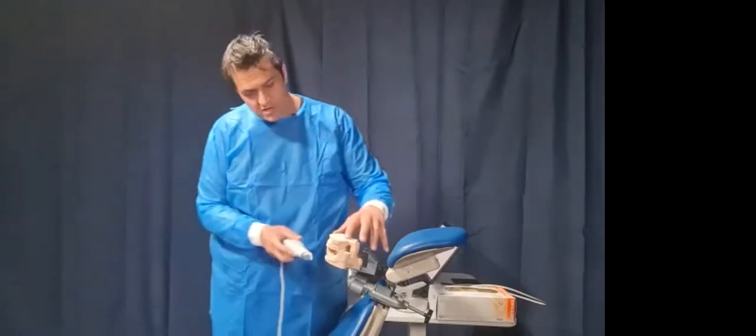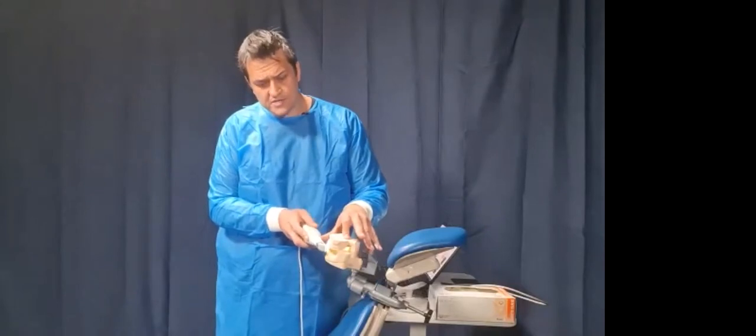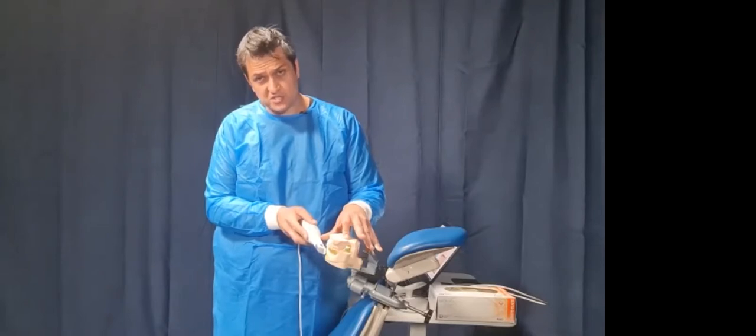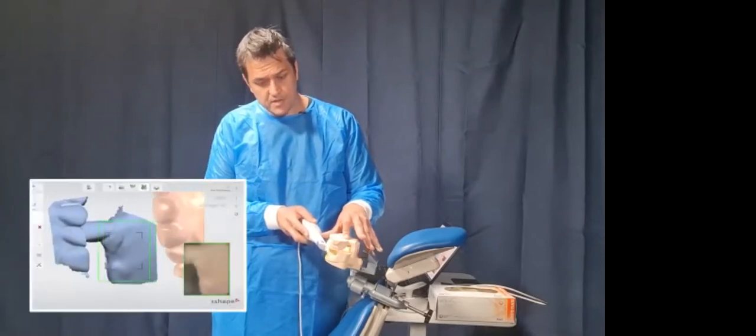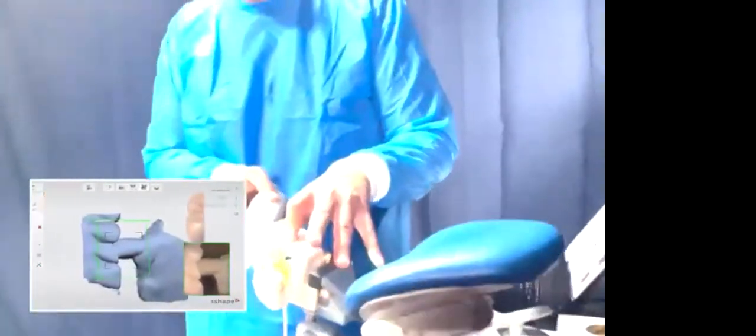So first things first, I start again right over the top of the proprioceptive contact points, which is the lower canine to the upper. Now I'll see if I can get the cameraman in again so they can see the path that I'm going to take. So again, I'm just running around. If you can go above, maybe, Mr. Cameraman. Yep. And I'm just running around and I'm catching. Now you can see if we cut across to the screen record, you'll see that I've caught the upper already.